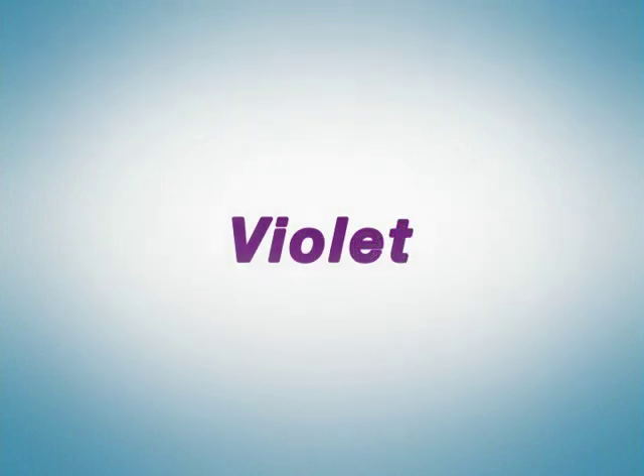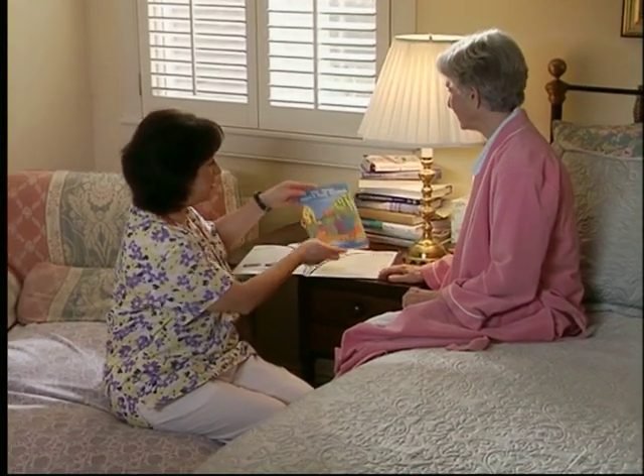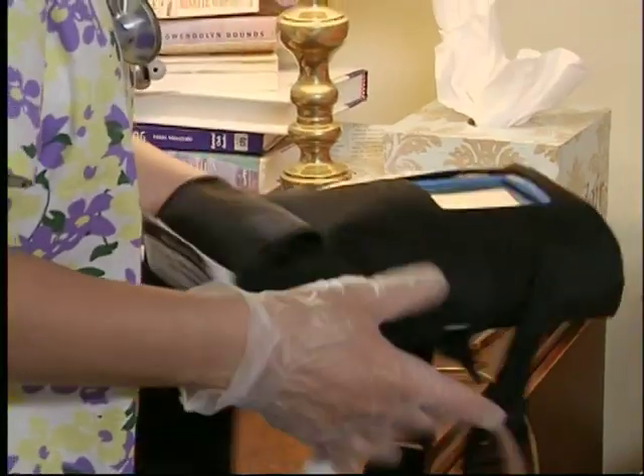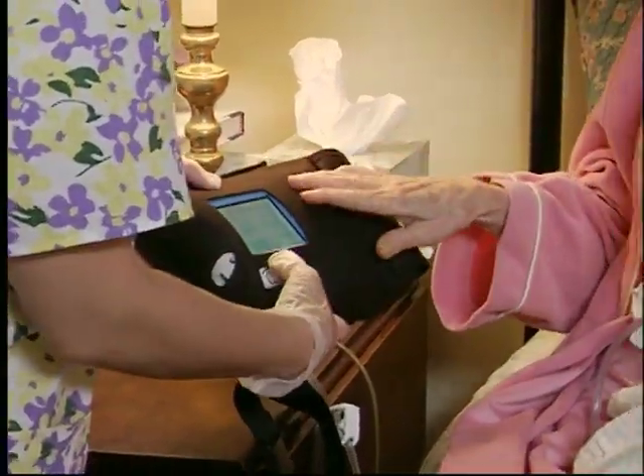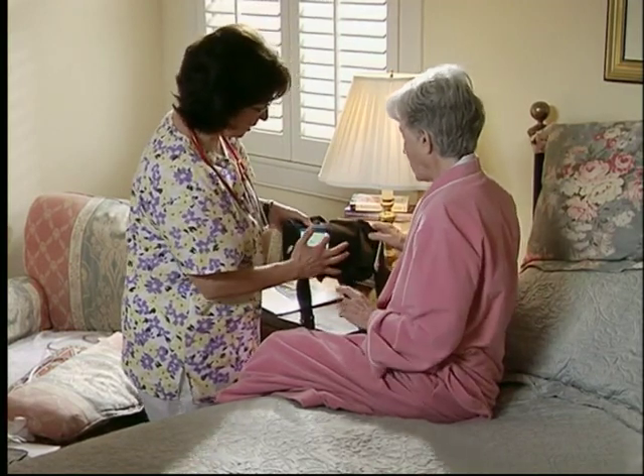Now, let's meet Violet. Keep in mind that, as with any medical device, it is important to review all instructions with your health care provider and make sure all safety information is understood. You can see right away how easy it is to operate and turn therapy on and off.